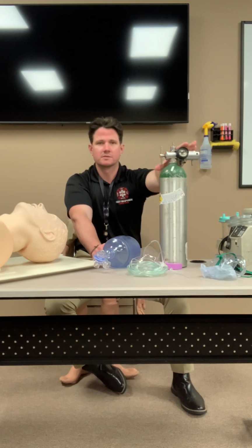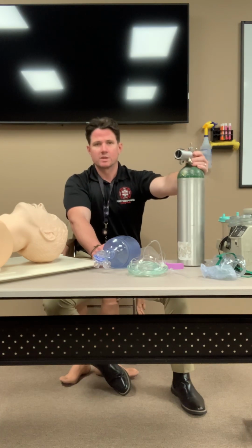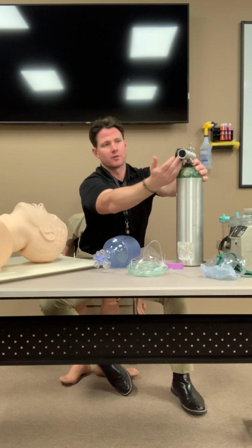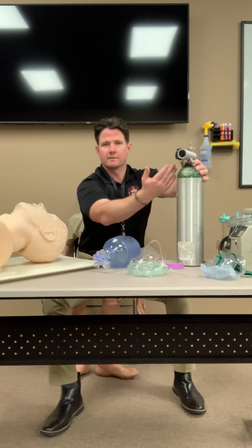So take it apart, take a quick look, make sure you have everything the right way, right? But if you have it on correctly, then we can continue. Once it's on, you're going to go back to your valve and open it up all the way, okay? Once you open it up all the way, you're going to want to verbalize the cylinder is charged now, and you're going to want to verbalize your PSI, all right?